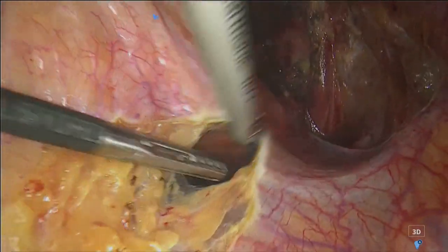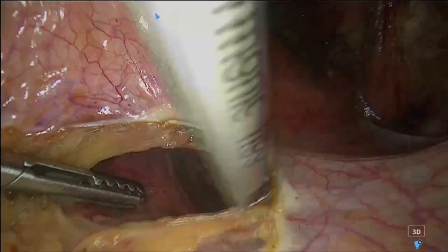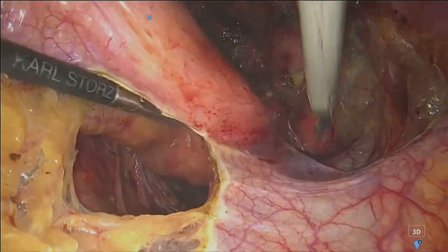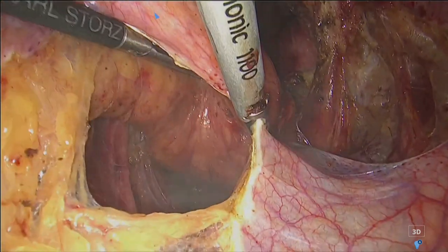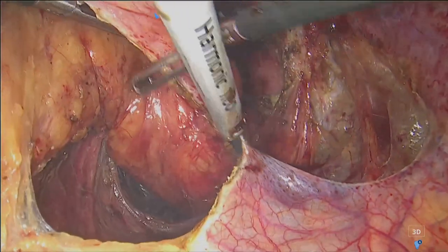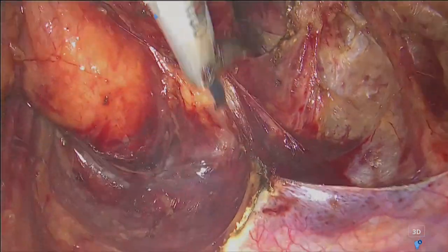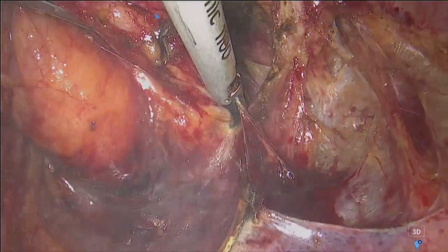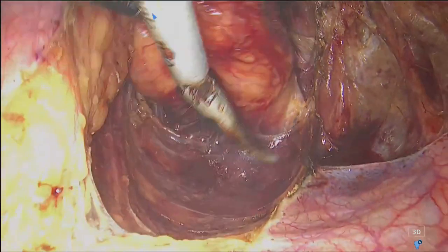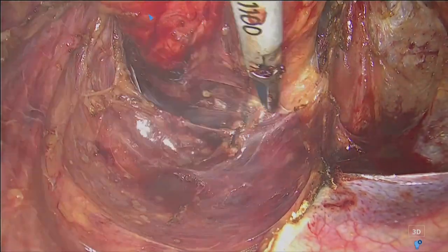So if I go down, I can see the left hypogastric nerves from the right opening of the peritoneum, and then we go down. This is the direction of the nerve. I stay close to the rectum, pushing up the rectum and down the peritoneum. So Mariana pull up the rectum. I stay close to the rectum. This is important because I have to increase the distance and the mobility of the rectum, because we have a very low nodule, 7 centimeters from the anal verge.